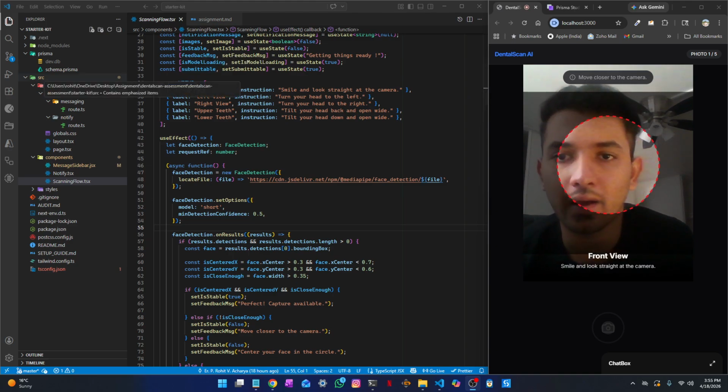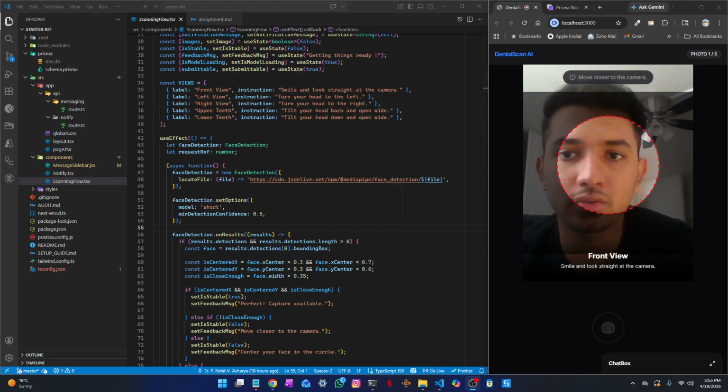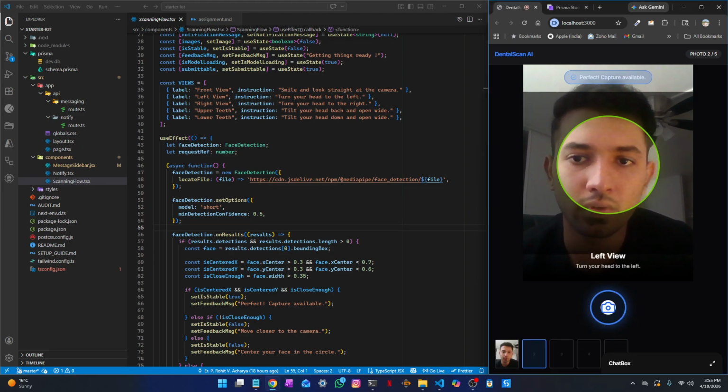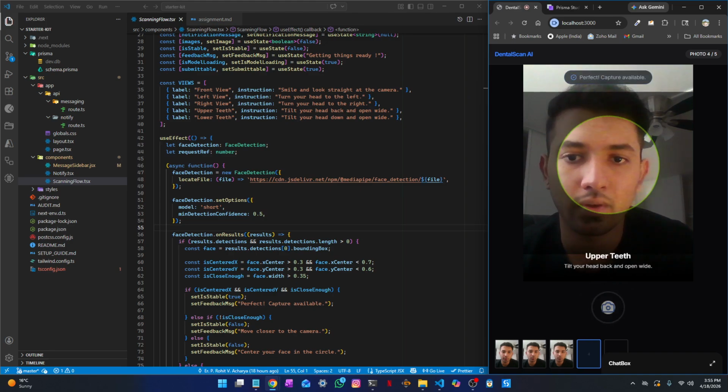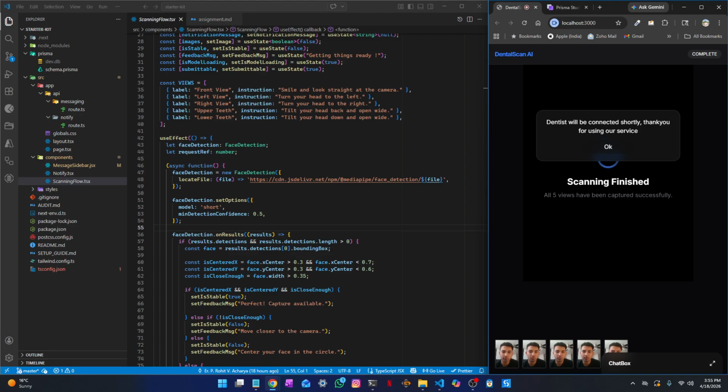So the user can actually take the front view and the left view and all the five views, and after clicking it will notify that the scanning has been finished, and the user can submit the 5 photos. So I'm clicking on submit. As soon as I click on submit, it will notify that the dentist will be connected shortly, and thank you for using the service. And right now I'm clicking on OK.